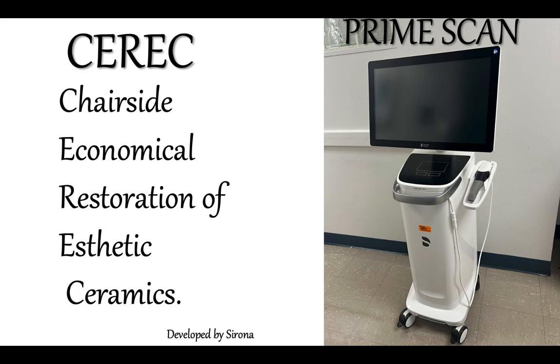If you have a lab in the same office, you can do the scanning, then wait, probably go to another room and see another patient while your lab technician in your own clinic does the design and milling for you. And then you come back to the room just to cement.